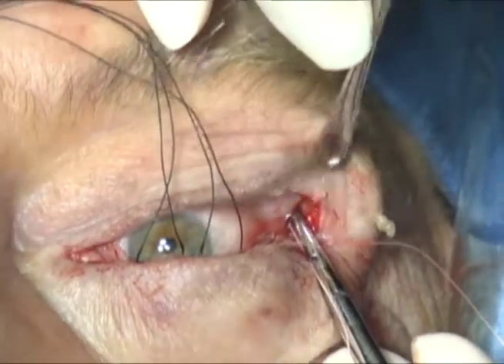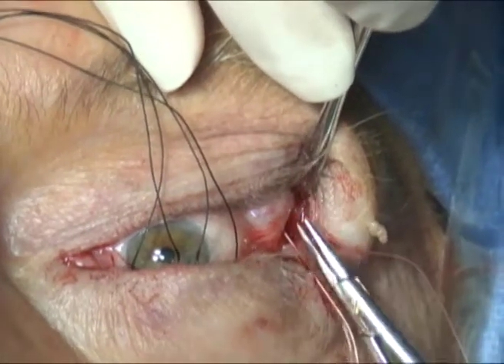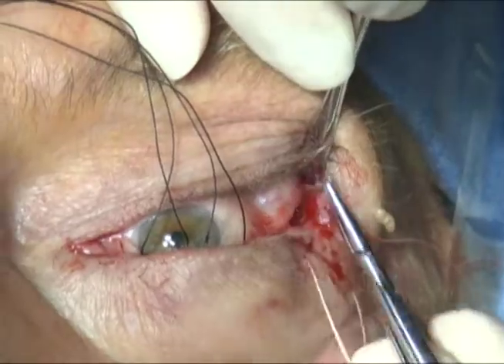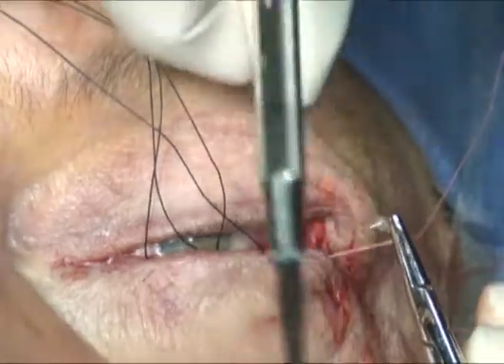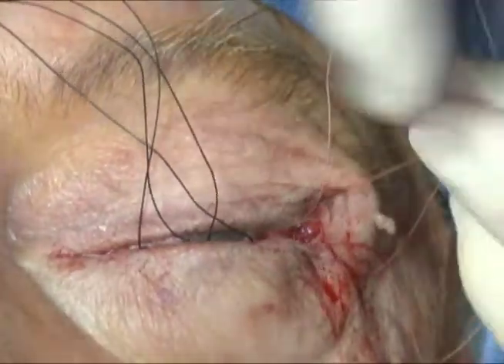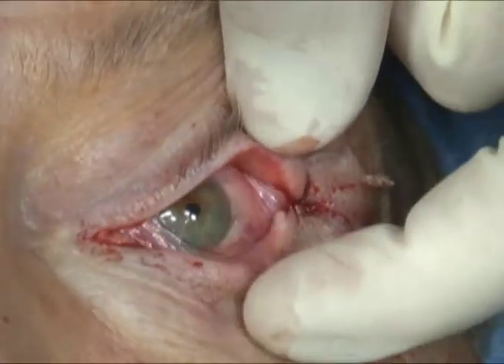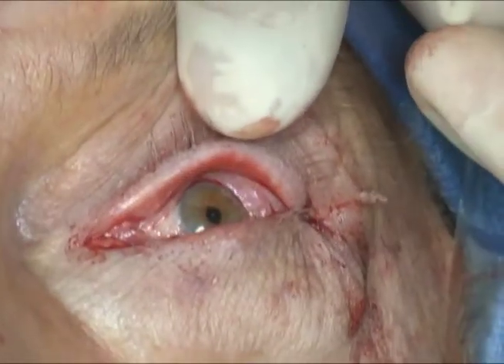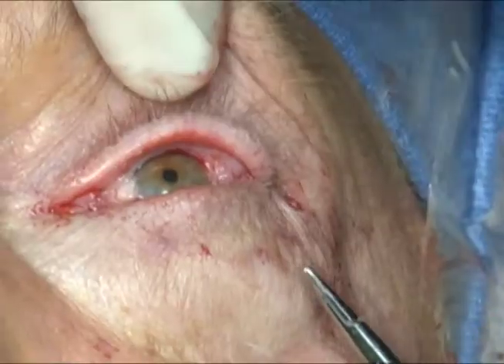The needle then engages the periosteum of the lateral orbital rim at the level of Whitnall's tubercle, placing the strip in a superior and posterior position. The sutures are then tied, the redundant anterior lamella is excised, and the cantholysis is repaired with a 7-0 vicryl suture.